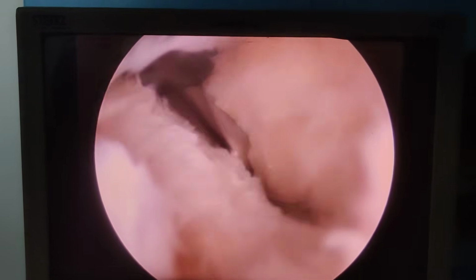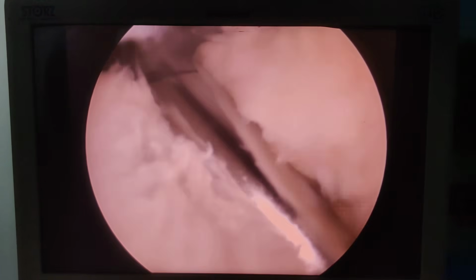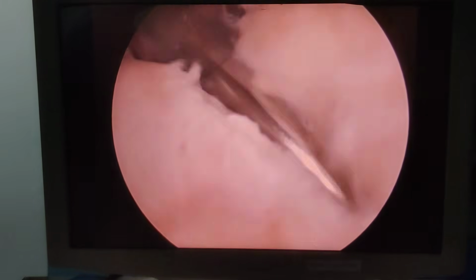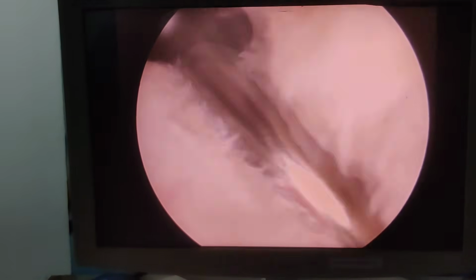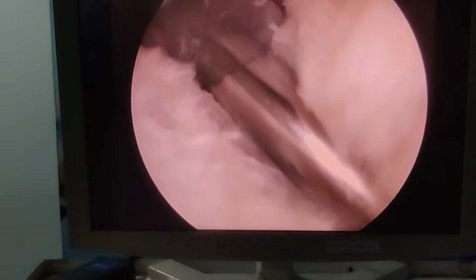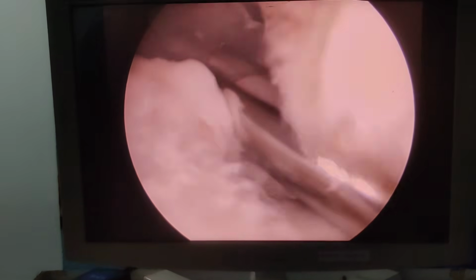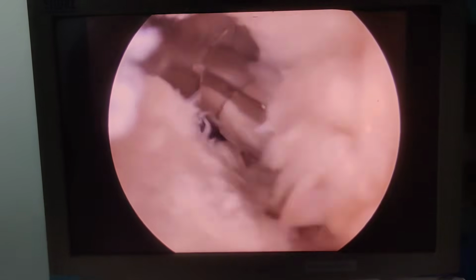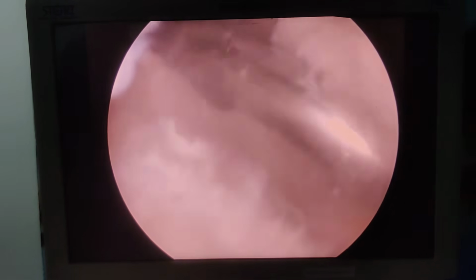So if you are doing combined ACL PCL, actually your life is much easier because the ACL is also out of the way. Now because our ACL is intact, it just makes our life slightly more difficult. But you can see that I am staying close to the bone, and also the other difficulty that I have is that I have only a 30-degree scope. If you have got a 70-degree scope, that will be very, very useful, because then you can look down. But anyways, let me keep working on the back, and once I have debrided it, then I will join you.